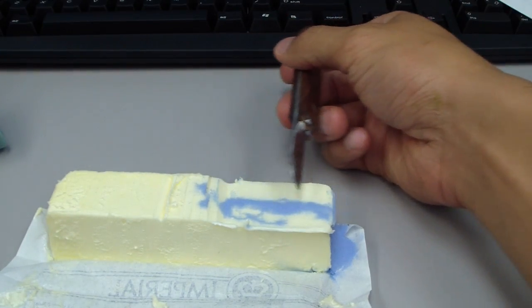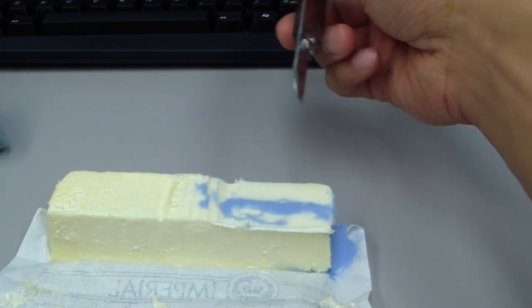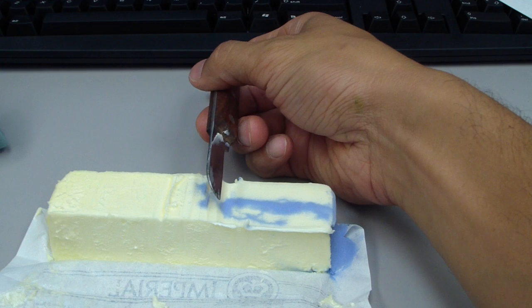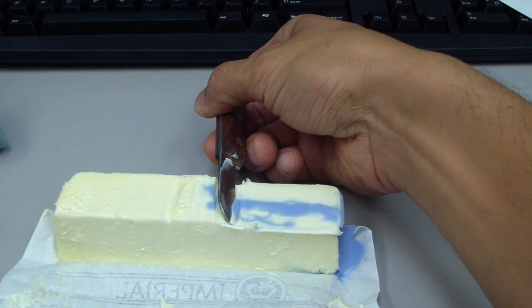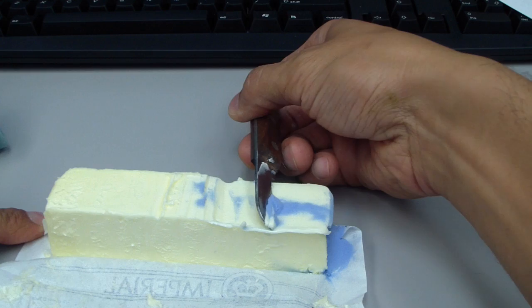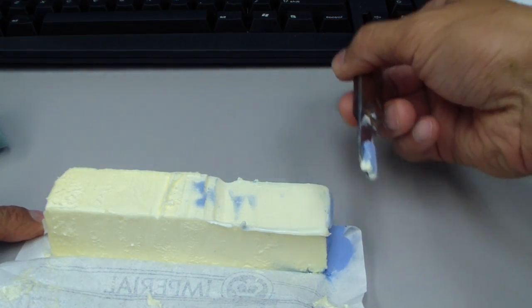So a positive rake angle relative to the direction of travel of my burr results in more of a cutting action.